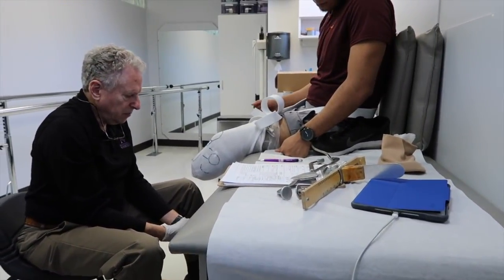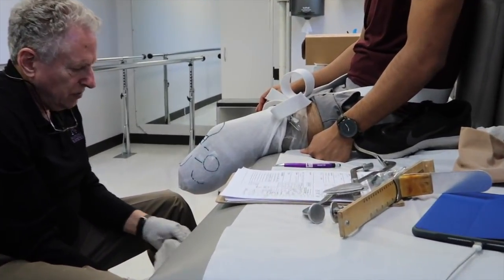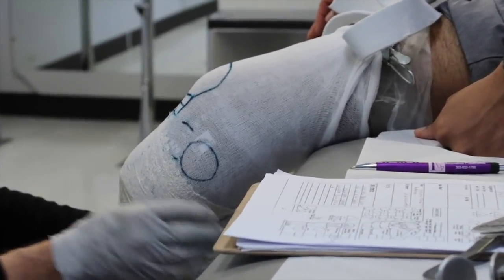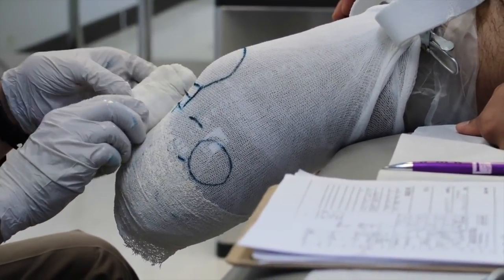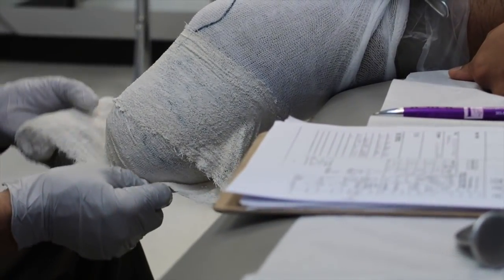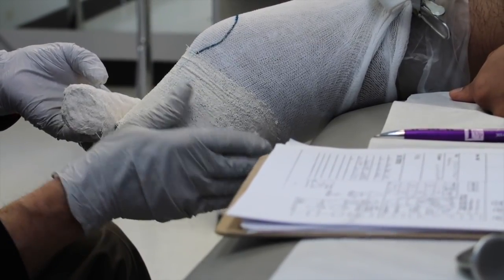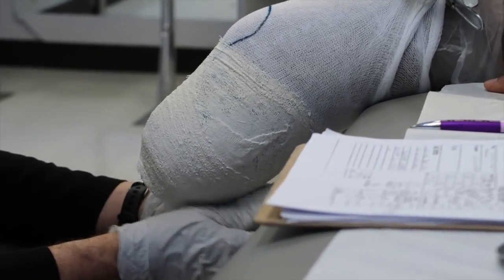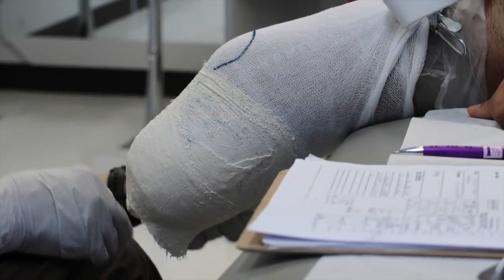This first layer of bandaging is plaster of paris that's impregnated into an elastic bandage, so it conforms nicely to the contours of your leg. The second layer is just fiberglass casting tape, and it gives the outside strength, because the plaster doesn't have a lot of strength on its own.